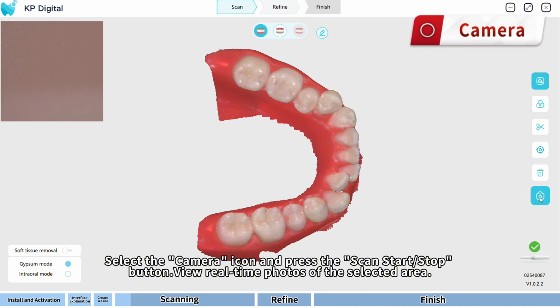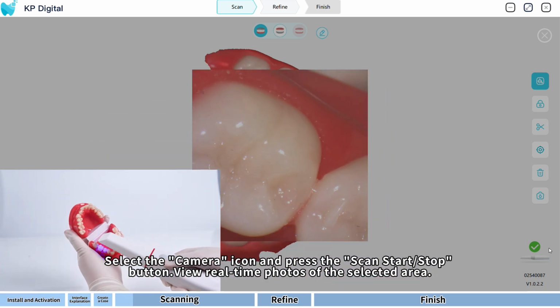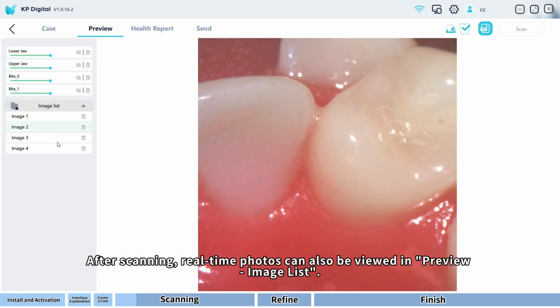Select the camera icon and press the Scan Start Stop button to view real-time photos of the selected area. After scanning, real-time photos can also be viewed in Preview Image List.